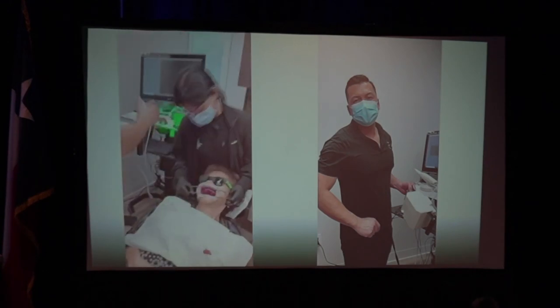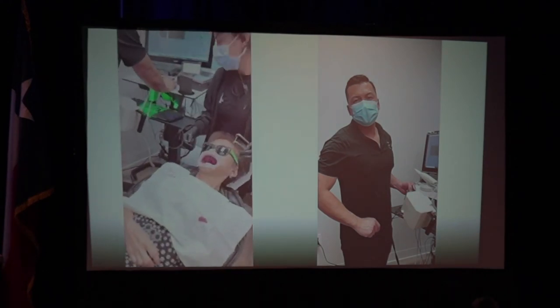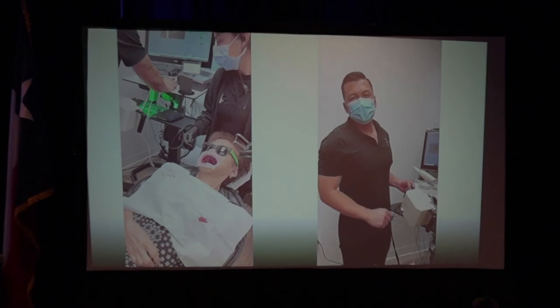And that's it. Got them all green. That's my verified impression because you guys can't see it, but all those implants on the top are green. Once they light up green, you're verified. It can be yellow, and yellow can still work depending on many views. That's what I mean by this is the only verified impression-taking method in all of dentistry. So we don't need to show that.